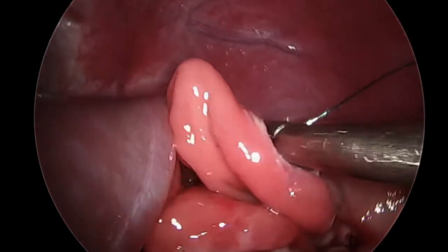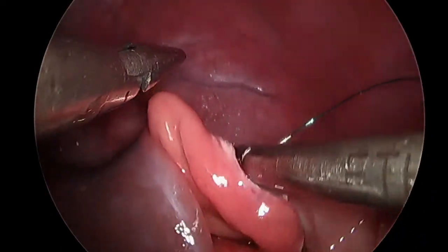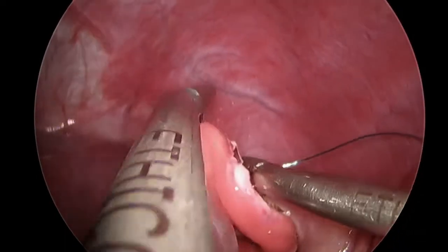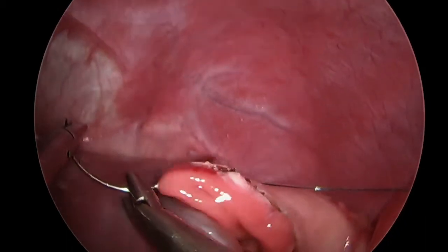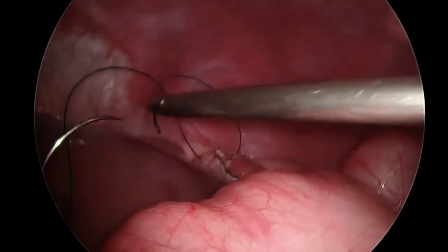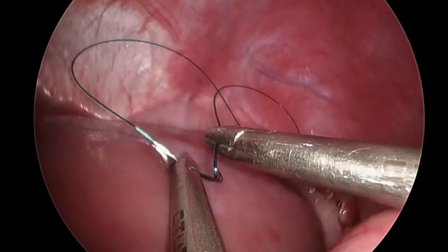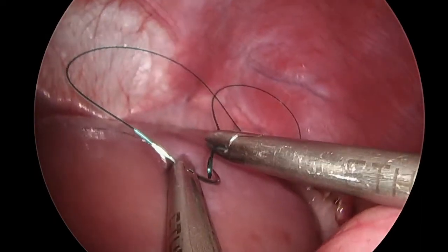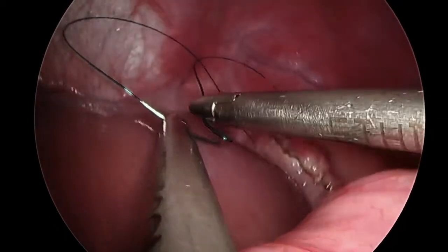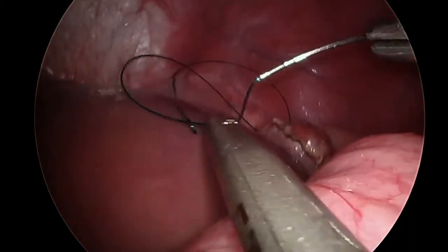The gastrotomy was closed using a 3-0 V-lock suture in a single layer. The V-lock suture has a loop on the end, visible here, that allows for omission of formal knot tying, thereby saving time. The rear-facing barbs on the suture ensure a tight closure and a secure suture line.